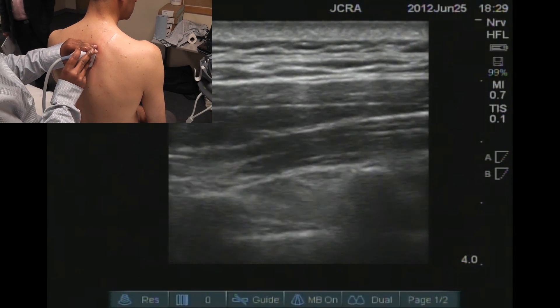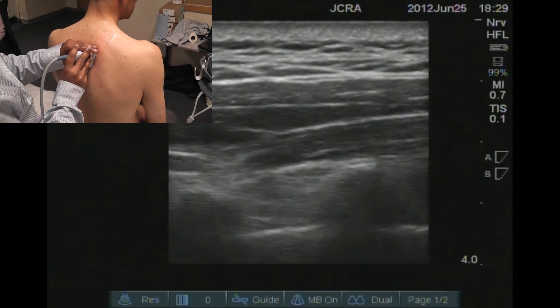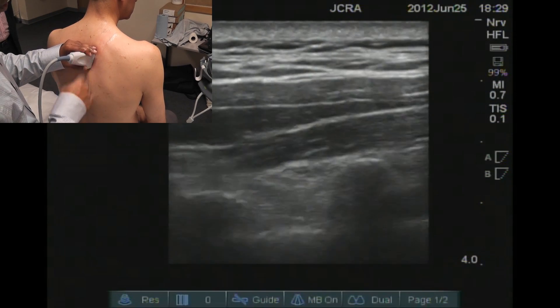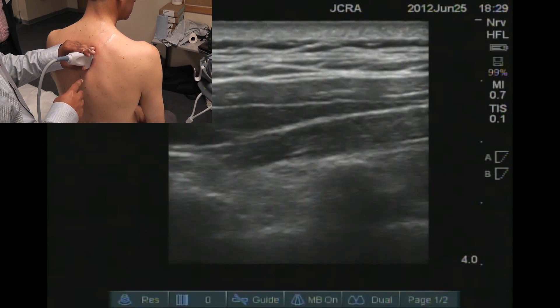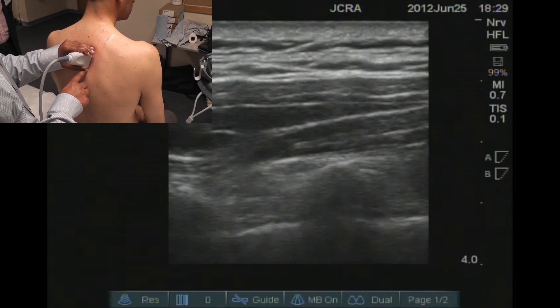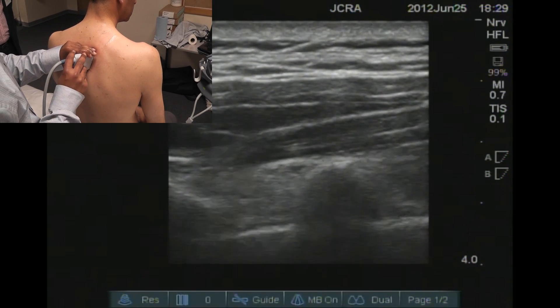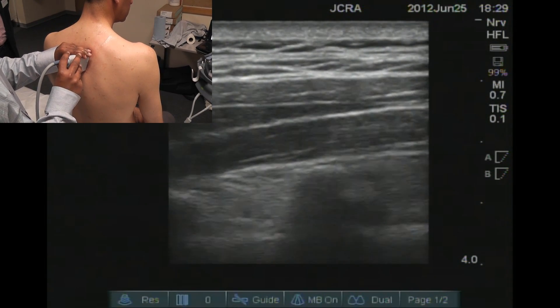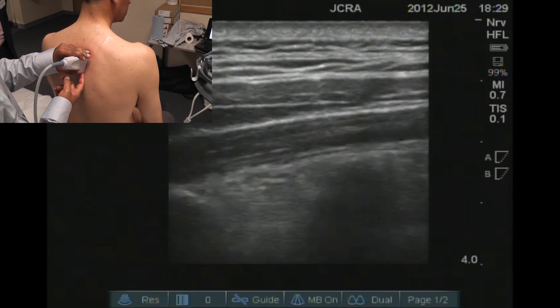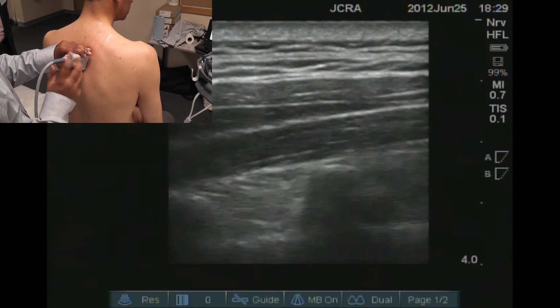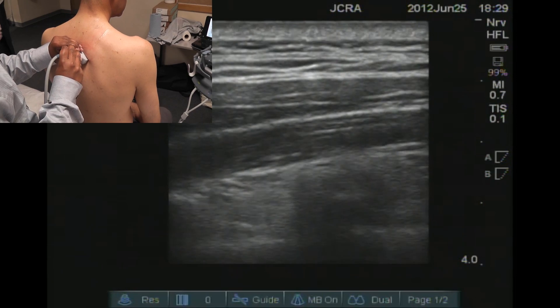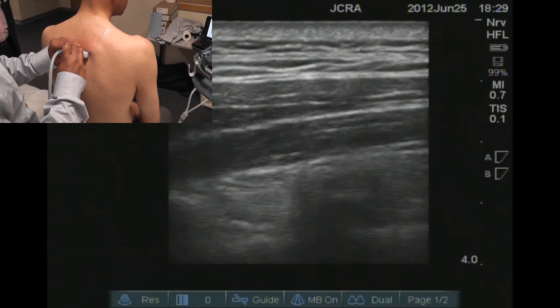You can place the probe on the longitudinal plane and do an in-plane technique. Obviously the transverse process is not going to be best visualized and the membranes are not best visualized in this position, so we often end up rotating the probe at that level.